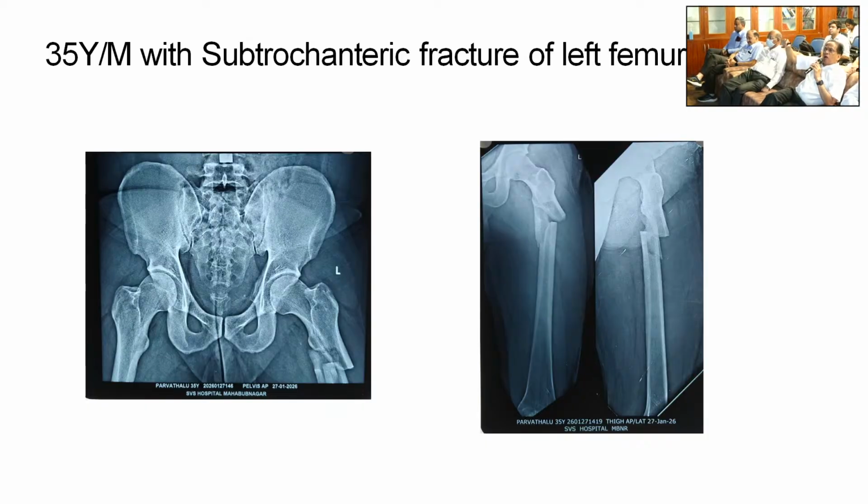Guide wire, you pass, cannulated, all. Understood? Yes, not a big guide wire, a small guide wire. Extends up to there. Yes, all. And open up this mouth, a bigger mouth. Then pass the guide wire. Then you ream it. But you don't do that most of the time. You just make an entry point and pass the guide wire. That's why you end up in trouble.